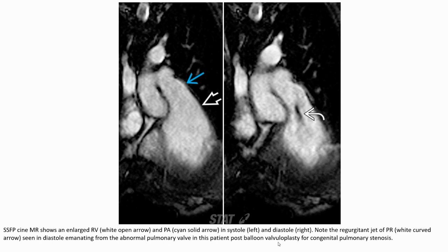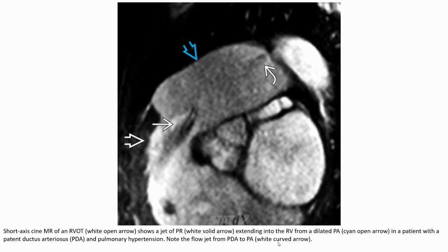This image shows enlarged right ventricle and pulmonary artery on MRI. Another image demonstrates pulmonary regurgitation with an arrow indicating the jet arising from the abnormal pulmonary valve in this patient with congenital pulmonary stenosis.